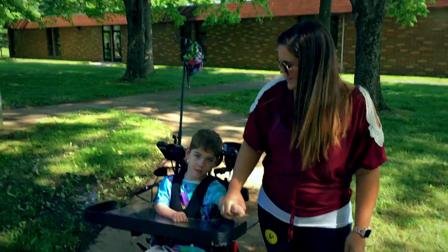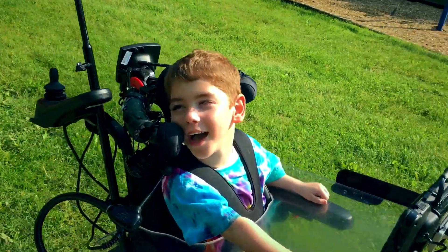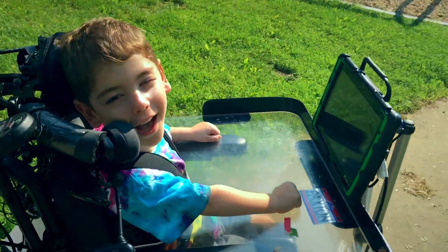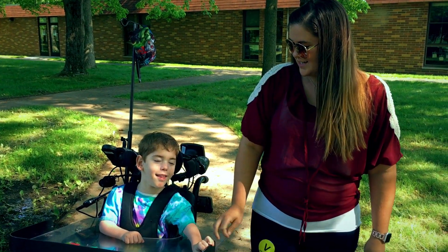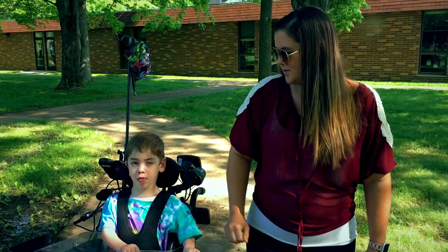This is Paxton. Paxton is a six-year-old little boy who has cerebral palsy. Paxton is a typical little boy at heart, and his power chair gives him the freedom to be just that — a typical little boy.